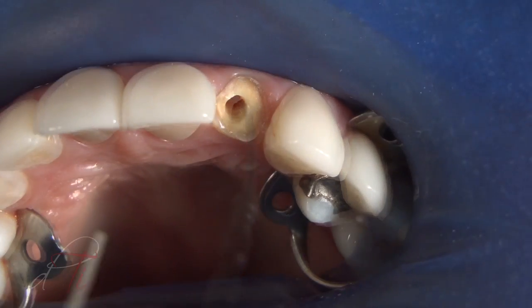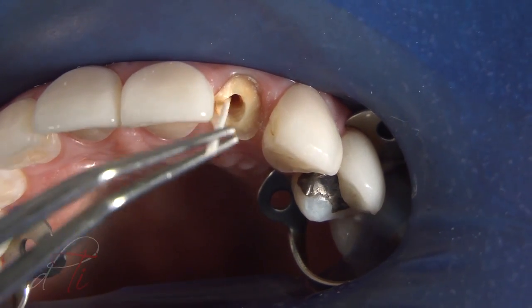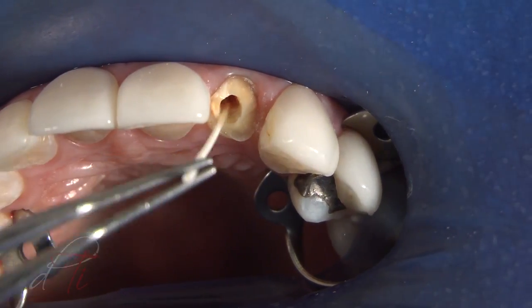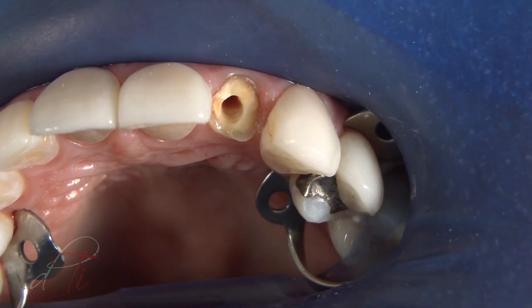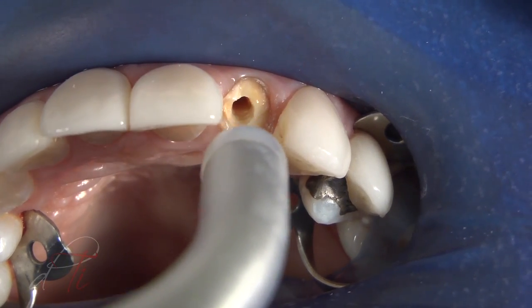An endodontic paper point was used to apply the adhesive along the walls of the post space and to the most apical areas. Any excess adhesive was absorbed with the endodontic paper point using a rapid intermittent movement. The adhesive was lightly air-thinned using an ADEC warm air tooth dryer and light-cured for 10 seconds.